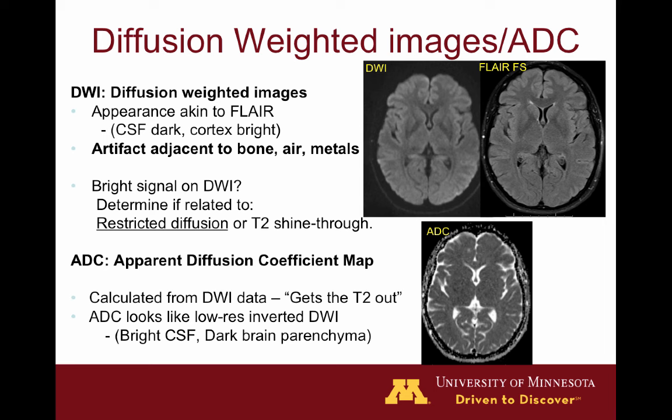Diffusion-weighted images have some T2 weighting to them, so things with a lot of edema will sometimes show up slightly bright on DWI. Therefore we use a second set of images called the ADC map, or Apparent Diffusion Coefficient Map. It looks like an ugly low-resolution T2-weighted image, but it shows us exactly a picture of water diffusion. High signal on ADC represents freely moving water, and dark signal means not very mobile water.